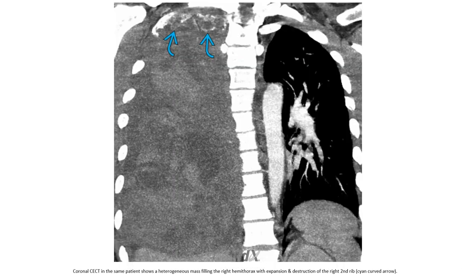The same patient on contrast-enhanced CT shows a heterogeneous mass filling the right hemithorax, with expansion and destruction of the right second rib.